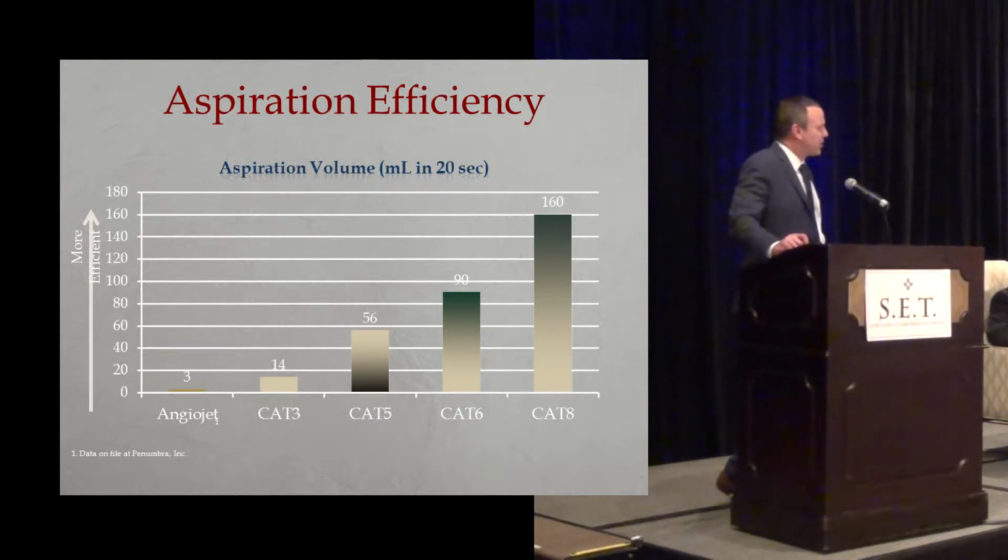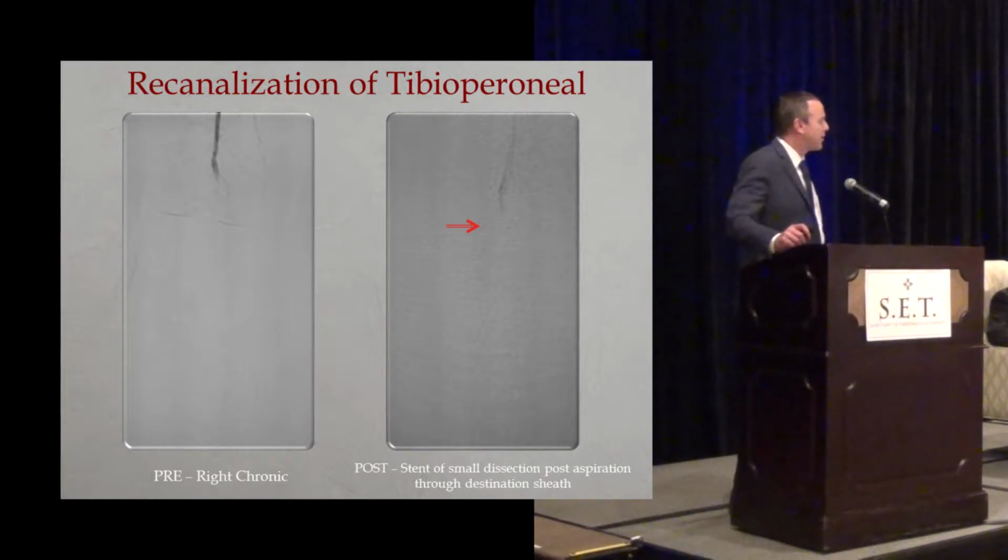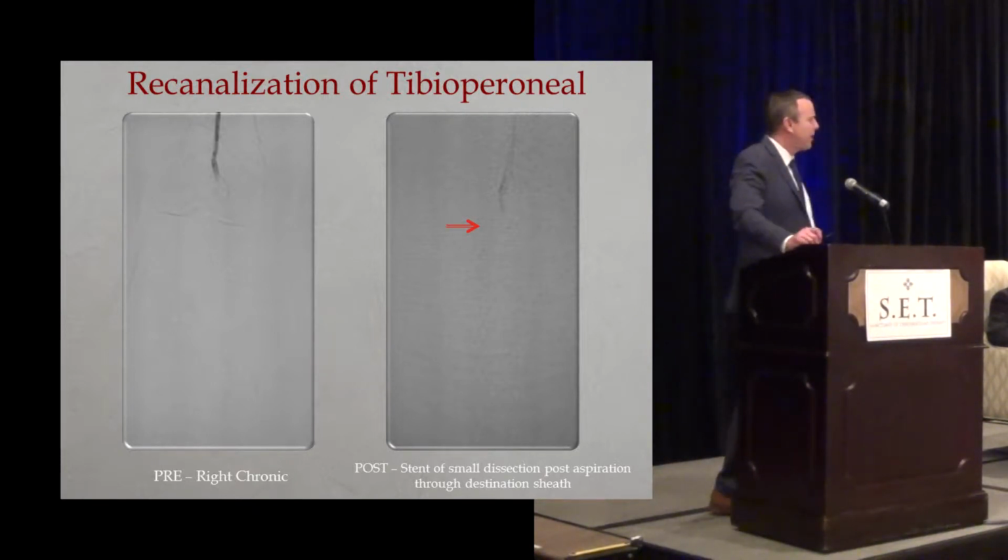So I'm going to go through just a couple cases here and give you some case examples of how it's utilized and some different techniques. This is the first case, a recanalization of a tibioperoneal clot. This is a patient who came in with bilateral emboli to the lower extremities from atrial fibrillation, taken off of Coumadin for a colonoscopy, and then 3 days later she presented with bilateral lower extremity ischemia. And you can see here she shuts off the right tibioperoneal trunk.